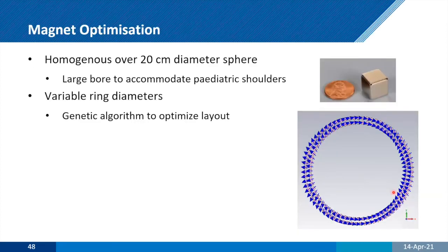And so here's what our system looks like. Again, we were trying to think not only from the point of view of theoretically getting the best magnetic field, but suppose you want to manufacture this. And supposing even more so, you want your sister site in Uganda to be able to manufacture this. What can we do to make that an easy and trainable approach?